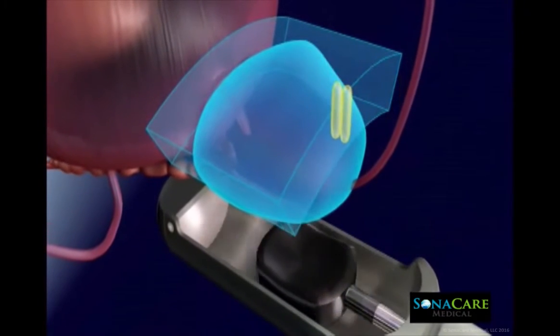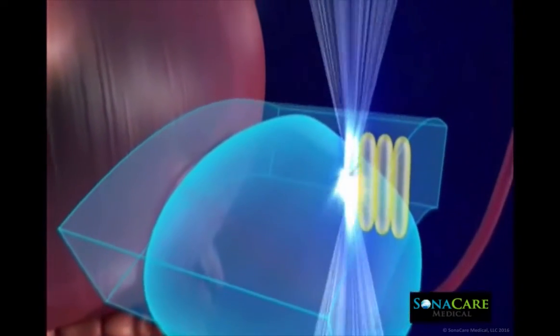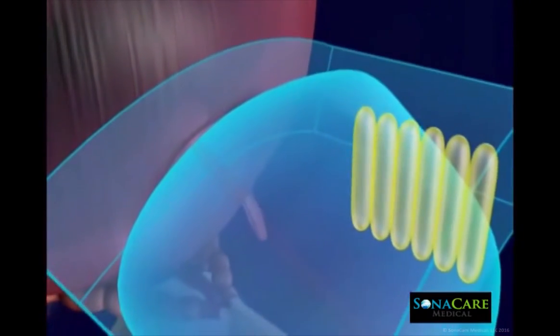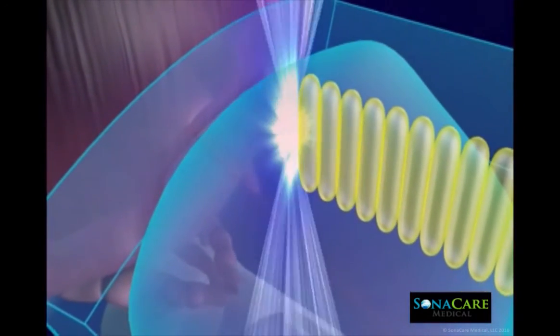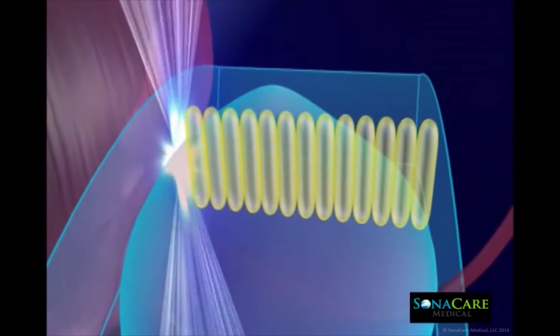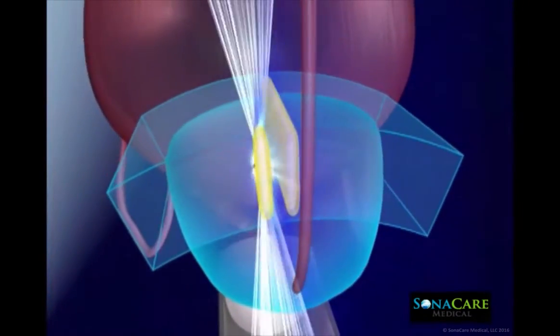The result is an accurate and repeatable lesion at the target sites, monitored by the treating physician in real time. All ablation zones are pre-planned and checked by the physician prior to starting the HIFU procedure. Every ablation lesion is specifically planned around the identification of critical anatomical structures such as the prostate capsule, seminal vesicles, rectal wall, and neurovascular bundles.